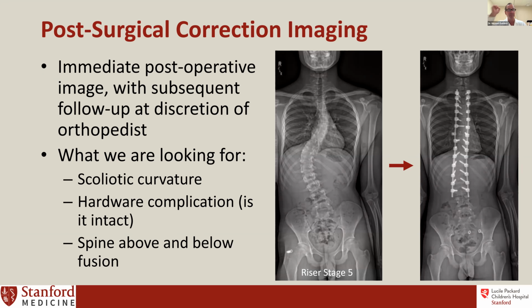It's a tricky thing. Now we're developing, and it should be FDA cleared soon, a tool to quantify the scoliosis on a smartphone at home without radiation. So in several months, you'll be able to follow it closely from home without getting an X-ray. But prior to that, we're still relying on X-rays to accurately determine the curve, progression and situation.